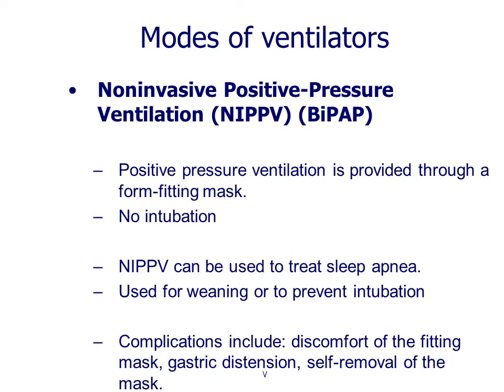Non-invasive positive pressure ventilation. Positive pressure ventilation is provided through a fitting mask ماسك كويس بالوجه. No need for intubation. And this non-invasive positive pressure is used to treat sleep apnea and also used for weaning to prevent or avoid the need for intubation.